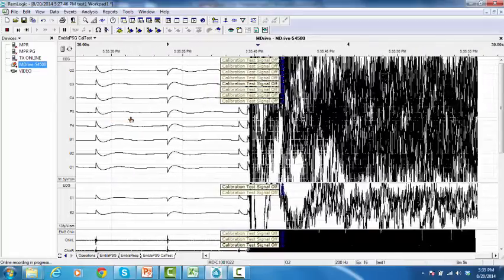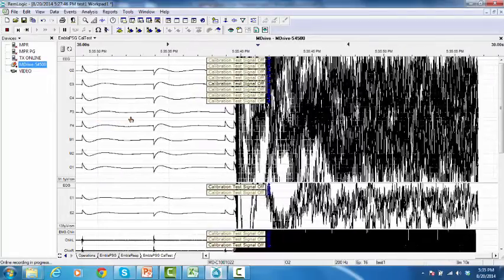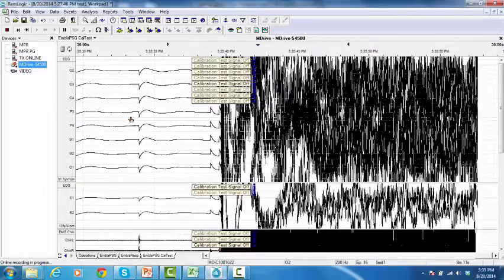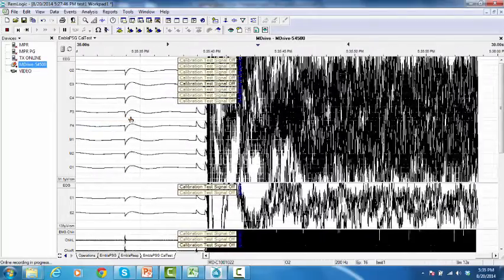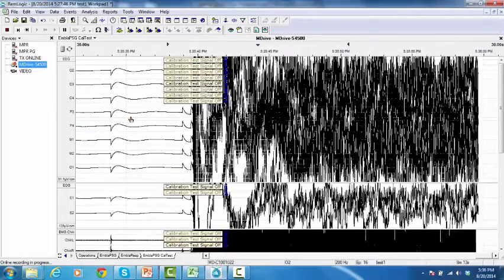Performing Impedance and Calibration Test during the recording is finalized.